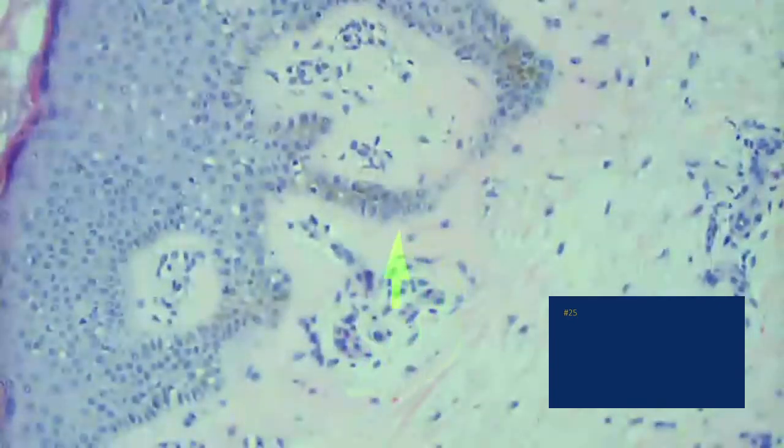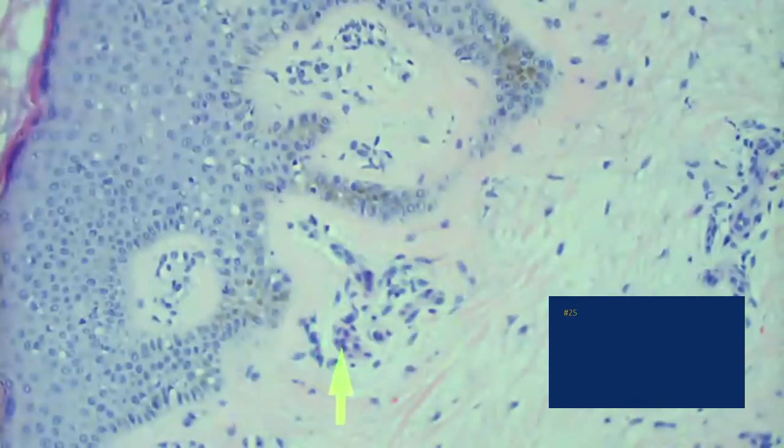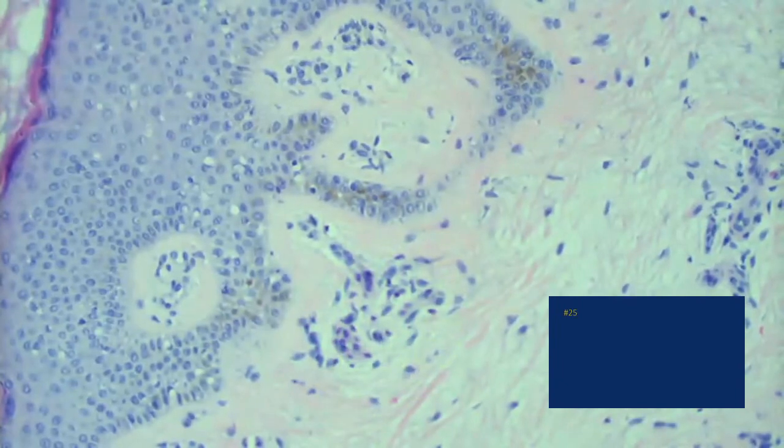Okay, it's tiny and superficial like that, with thick walls. Almost a little tough. Probably lower extremities. Yeah. Because there's stasis, altered blood. They've got to hold up the blood in the leg of a person standing. Stasis dermatitis, that sort of thing. So what's the diagnosis? So it looks like a deposition disorder.